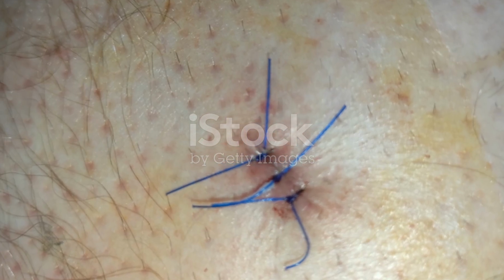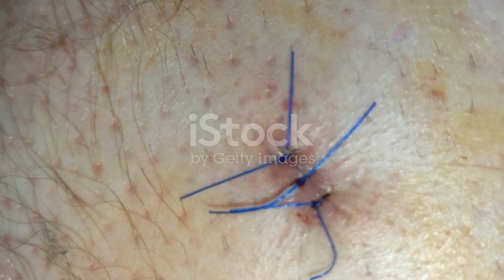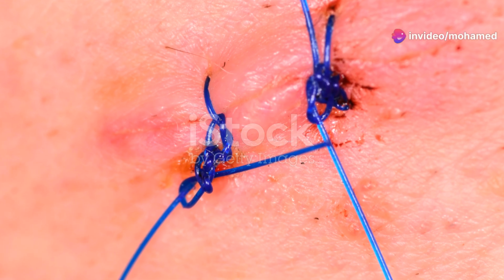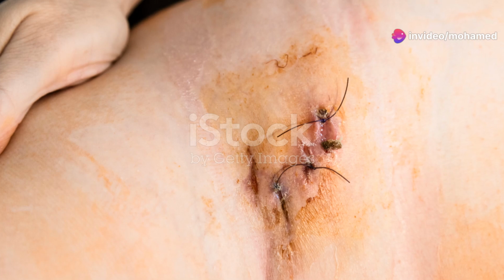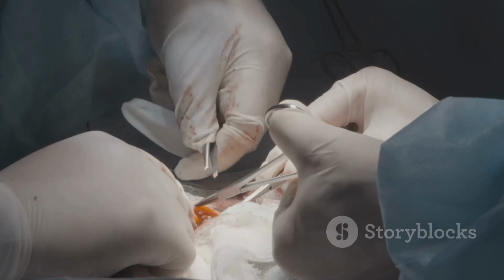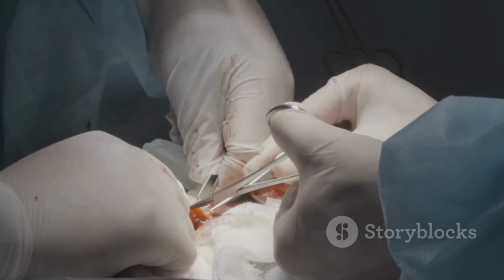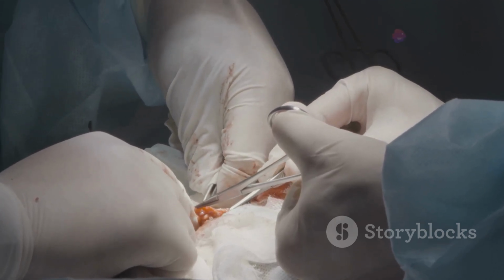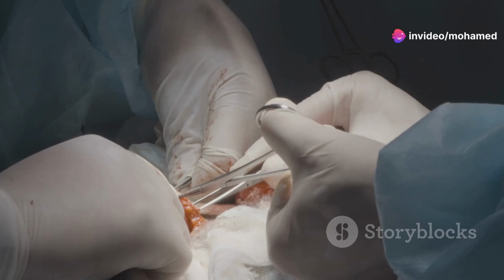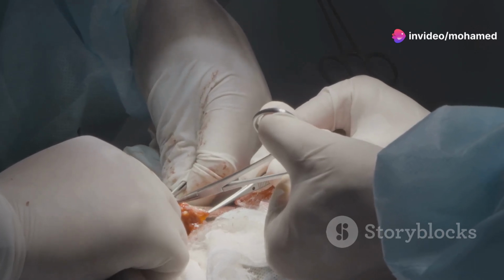And let's not forget, each type of suture comes in various sizes, from the thinnest 11-0 to the thickest 7. The size you choose will depend on the specific requirements of the tissue and the surgical procedure. You'll choose the size based on the type of tissue and the required strength. Thinner sutures are used for delicate tissues, while thicker ones provide the necessary support for more robust tissues.